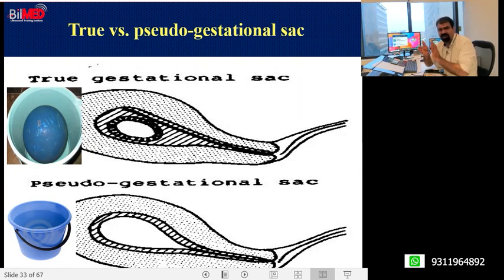How that is seen on ultrasound, that is a different part. That is part and parcel of our early pregnancy course. I will discuss a bit over here. So the point is, if I catch this unobliterated uterine cavity, am I ruling out ectopic pregnancy? Yes.